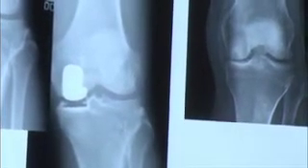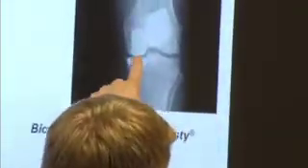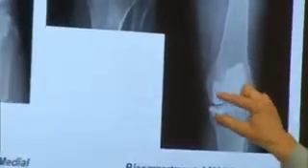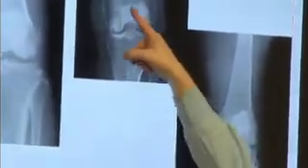So we use the metal version where we put a metal piece down here on the tibia. Can y'all see the difference there? The plastic that we put in there goes between these two pieces of metal, and that plastic functions as our cartilage. This was an example where we did the medial compartment, but we also did the patellofemoral. Underneath the kneecap, there's a lot of arthritis, and you can see the bright white sign right there. That's kneecap arthritis, and so that's why we replaced that as well.